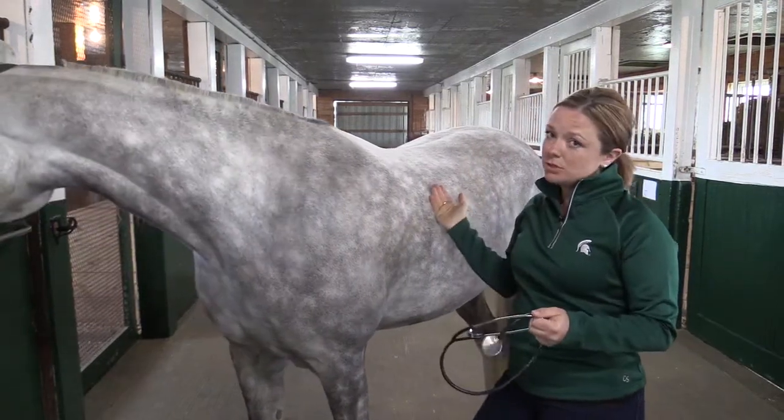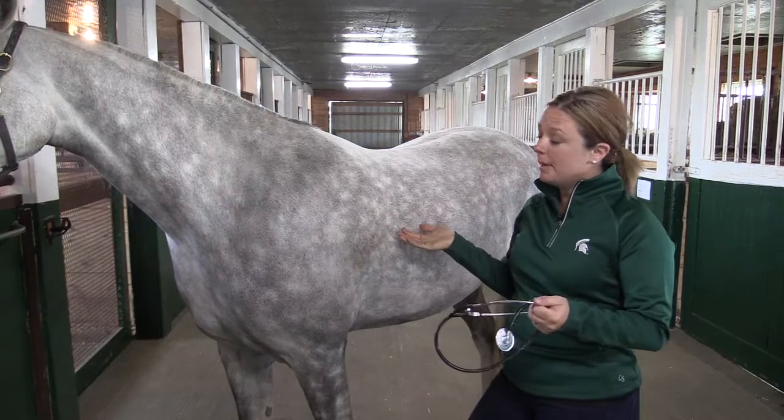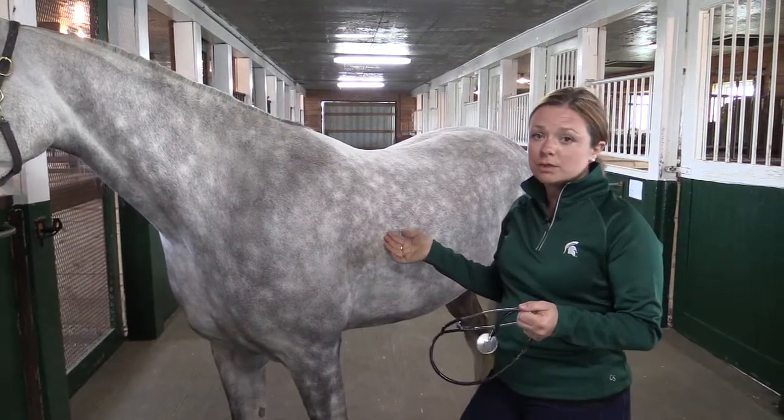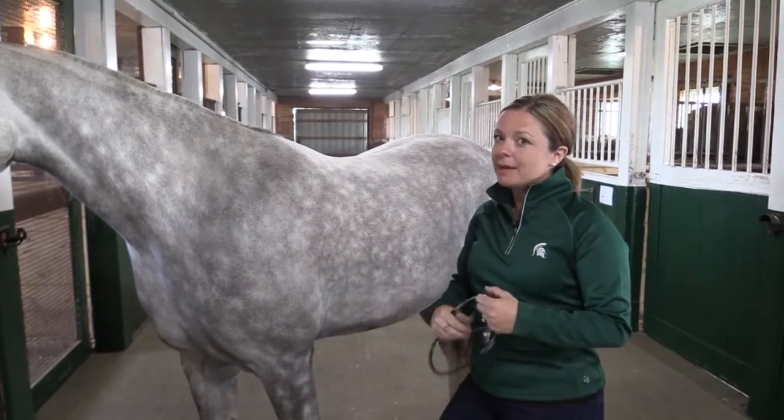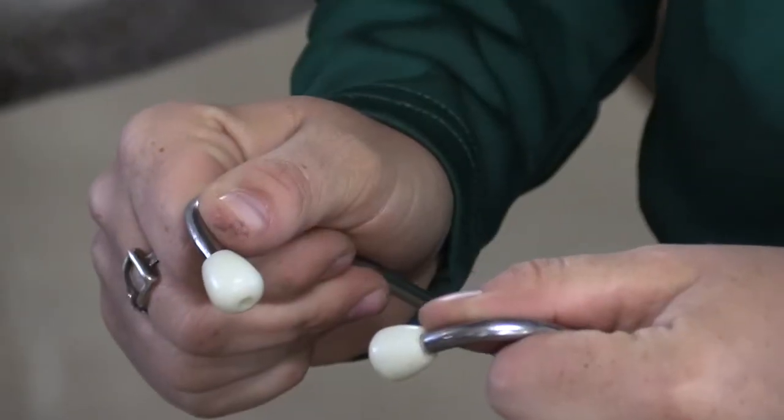My favorite way to do it is using a stethoscope. You can try to palpate and feel the horse's pulse with a couple different arteries, but I'll be honest, I haven't had much success personally doing that, but I always have success using a good old stethoscope.